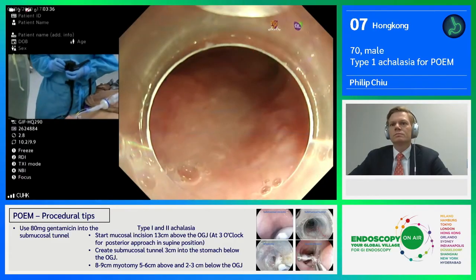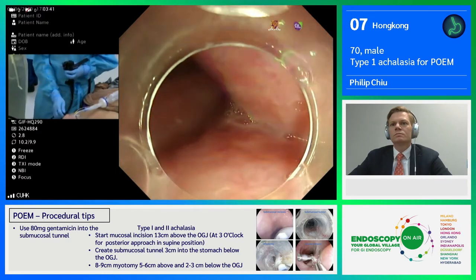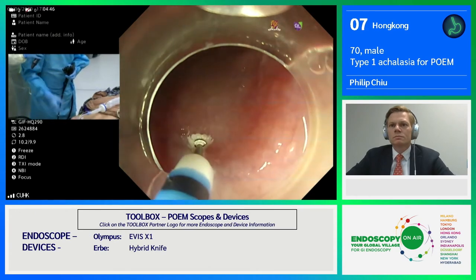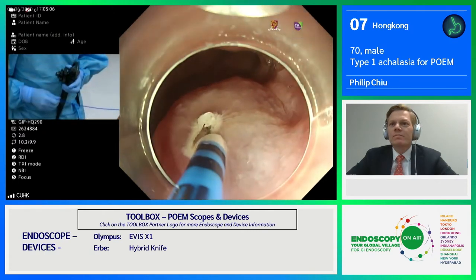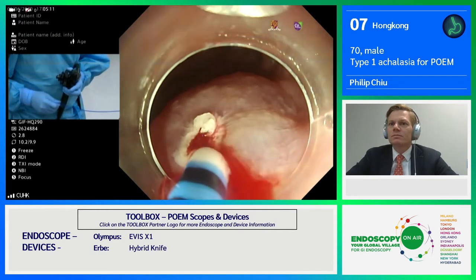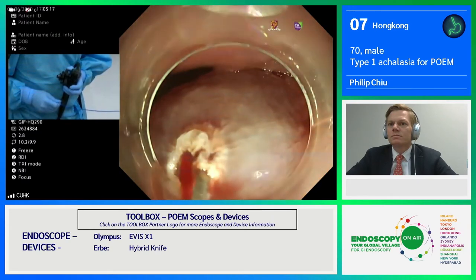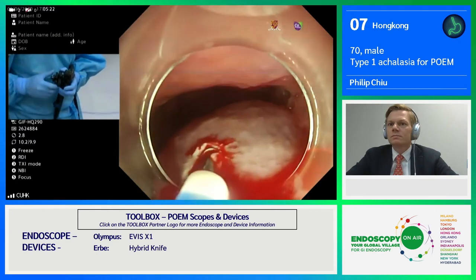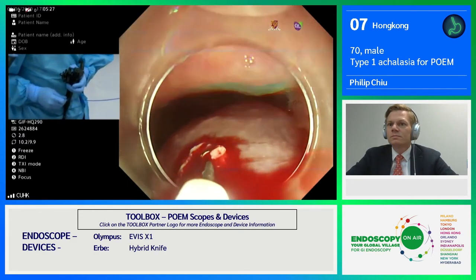I would develop a submucosal tunnel all the way to the gastric cardia from the posterior approach, using the hybrid knife. First I would have to make a mark, and then inject. The first incision should be very careful, so as not to go too deep. This knife is well designed so that we can make a mark in just one step. Then I can enter and with the water jet, I can create the space.